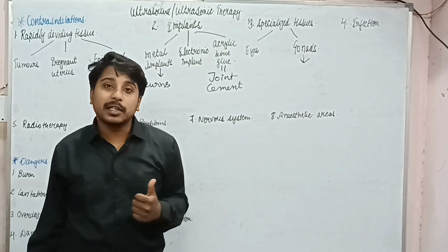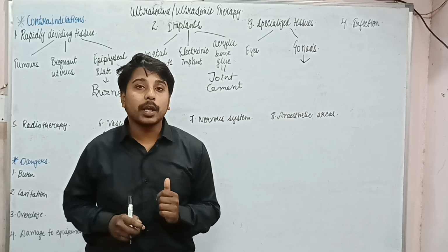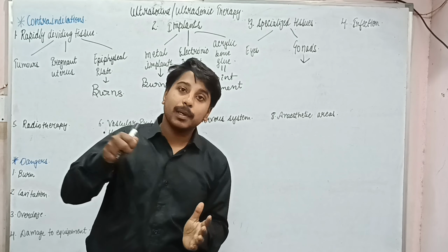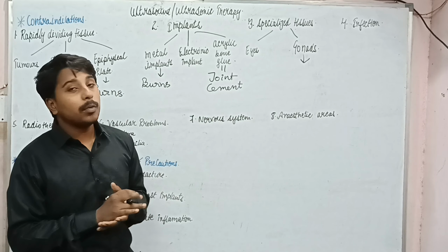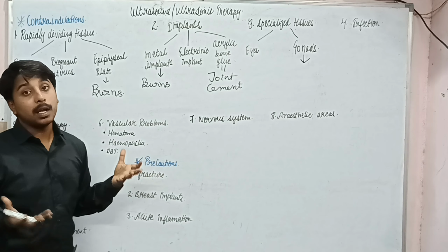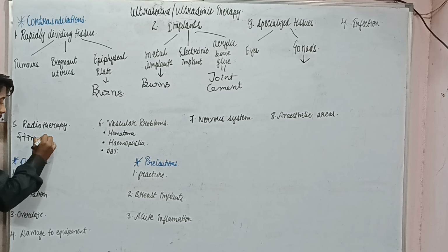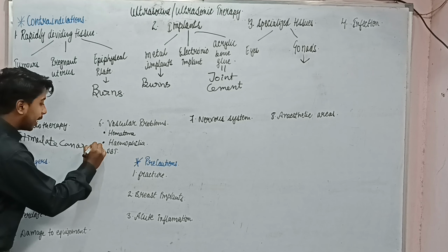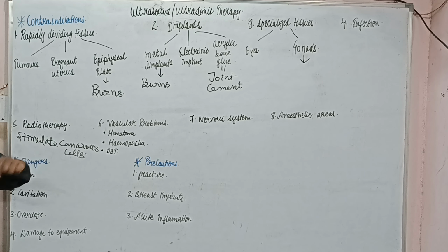In case of infection, if we apply ultrasound on a part where there is infection, it can spread, because we use the same transducer head for other persons also. So it can help to spread the infection, which is not a good thing. Next is radiotherapy. It can stimulate the cancerous or malignant cells.